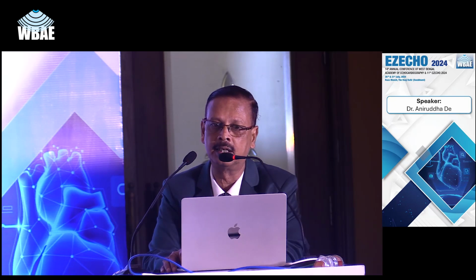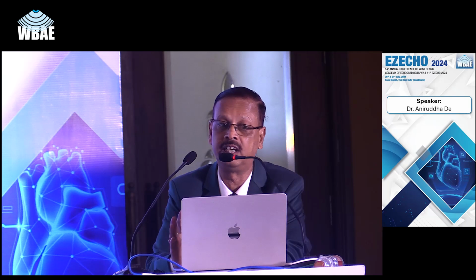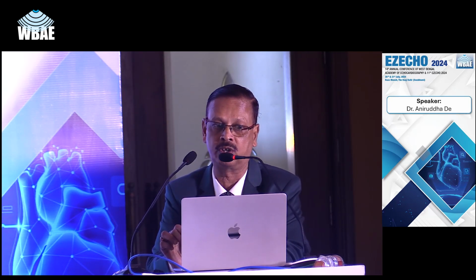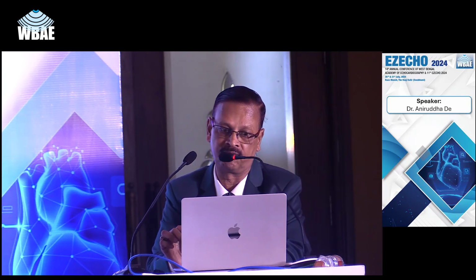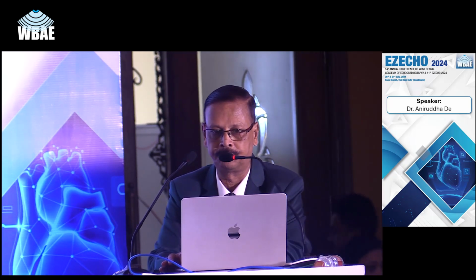LA volume you can do like in all cases in sinus rhythm, but with a little bit of caveat in this, that I am not going to discuss within 10 minutes. But the important second rule for determining the filling pressure in the presence of chronic atrial fibrillation is not to use atrial dimension, because regardless of the measurement type, volume or anteroposterior dimension, indexed or not, its increase does not correlate with increased filling pressure. This is due to the well-known mechanical remodeling induced by atrial fibrillation, which increases atrial dimension regardless of filling pressure. So this is a secondary one.